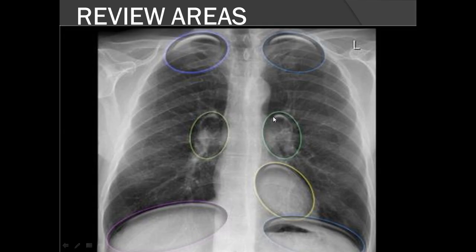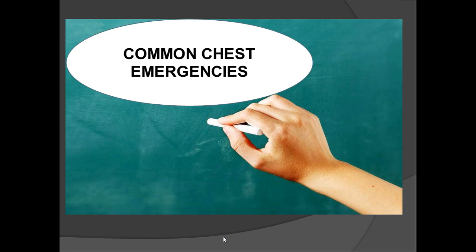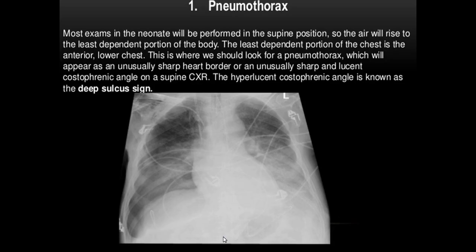The air within the soft tissue planes represents subcutaneous emphysema. These are the key review areas: the apices, the hila, the retrocardiac region — where hidden pathology such as a mediastinal mass or left lower lobe collapse may lurk — and below the diaphragm.